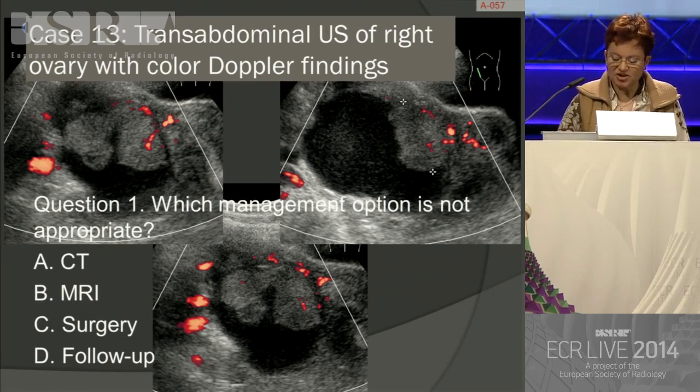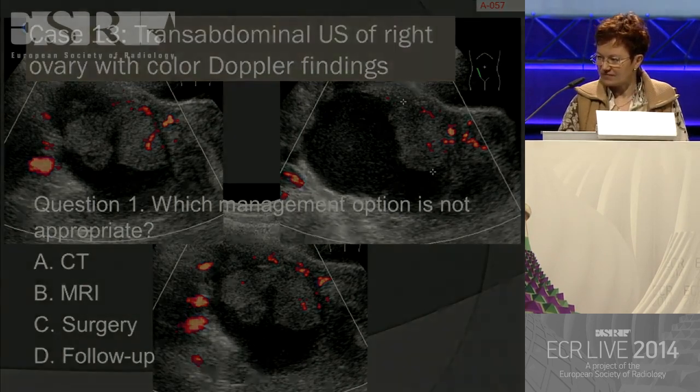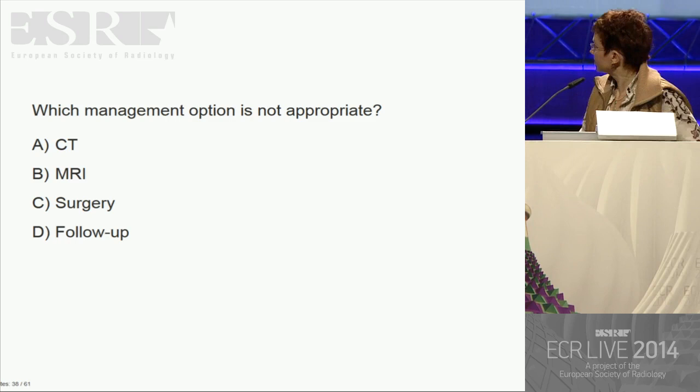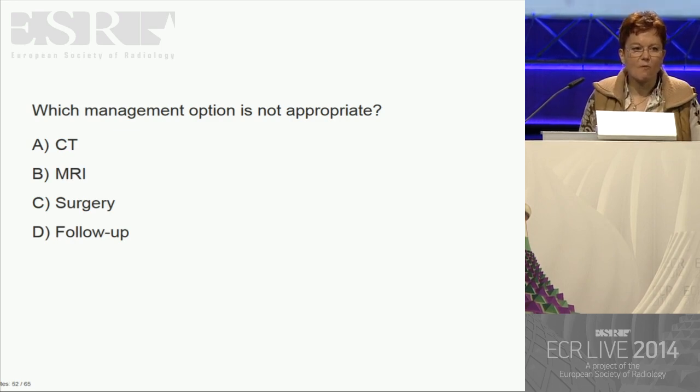So my question is, which management option is not appropriate? CT, MRI, surgery, or follow-up? Please vote.